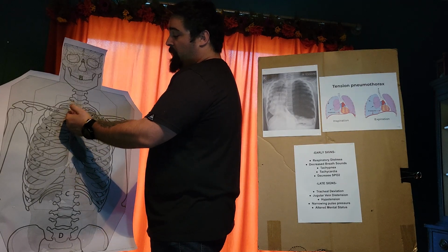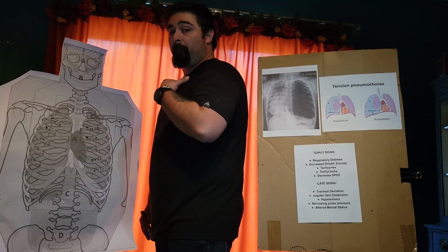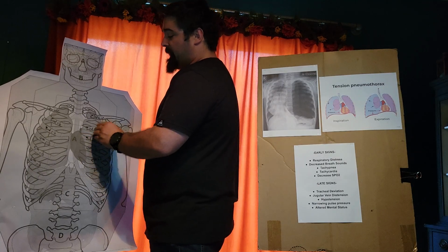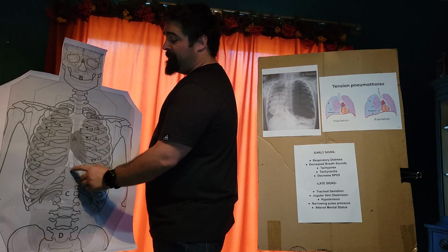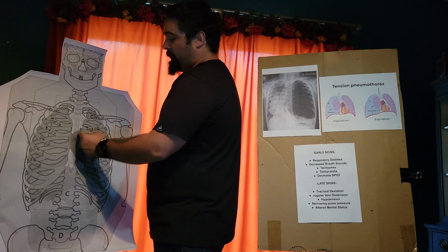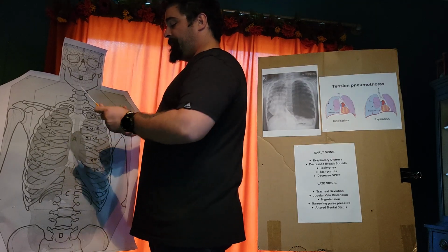Another way to feel, particularly in your larger patients, if you feel down from the sternal notch, the angle of Louis, you can feel the bumps down the sternum that indicate where each rib is located, and then you can follow that out correctly to the appropriate site. Again, for this, we're looking at mid-clavicular. You can see here the heart is located. If you're too midline, you're going to pierce the heart, and that's no good. We obviously understand that. We want to go mid-clavicular, so we're going to come down again, palpating down second, third rib. We want to go over the top of that third rib.